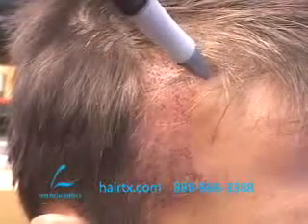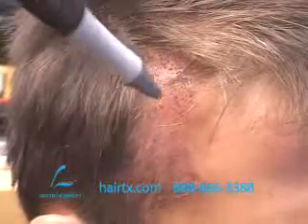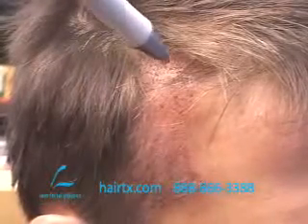Sagittal sites allow me to create a tighter focus here to blend the hair down and create a transition zone from his existing hairs. When you're at the point called the lateral canthus, the hair should go just slightly out and then down — there's almost a cascading element coming down, and that's what I've designed right here. As we get into the actual transition over to the temporal hair itself, we use coronal sites. Coronal sites are very, very flat. These hairs will fall out in a couple weeks, but I'm showing you with the long hair that these sites are flat. If the angles go out, they look fake.